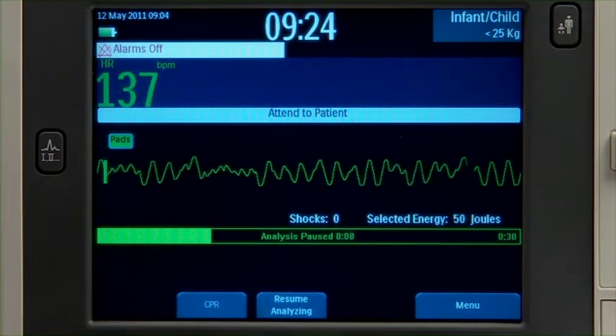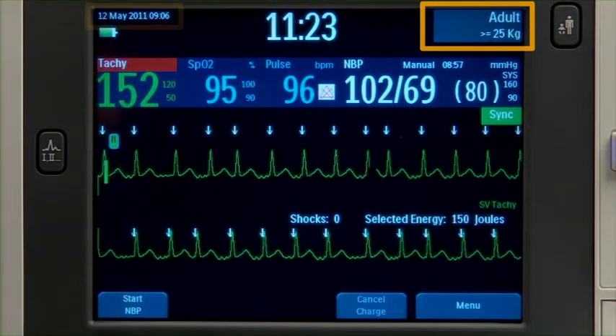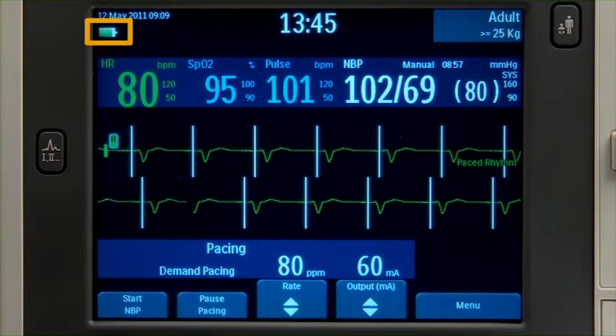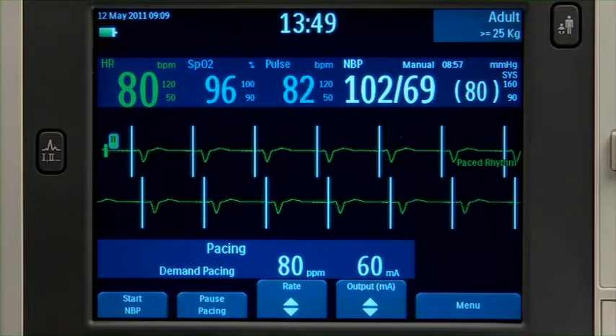All modes display general status information including patient category, date and time, and the battery power indicator. All modes, except pacing mode, display paced status if selected.